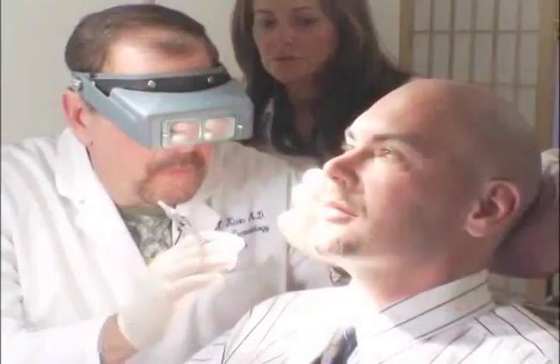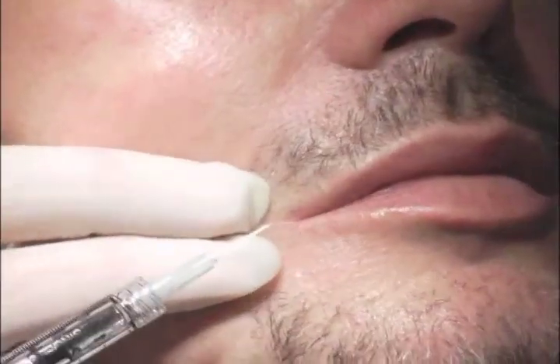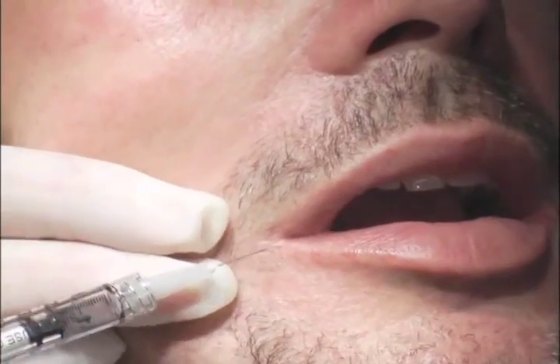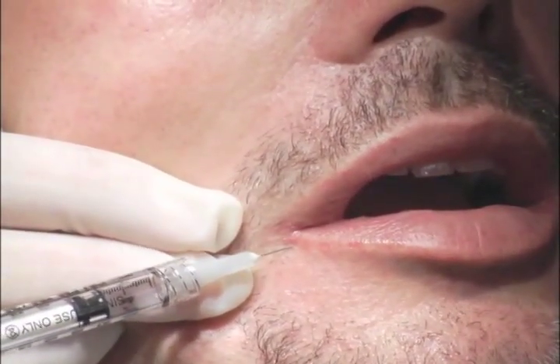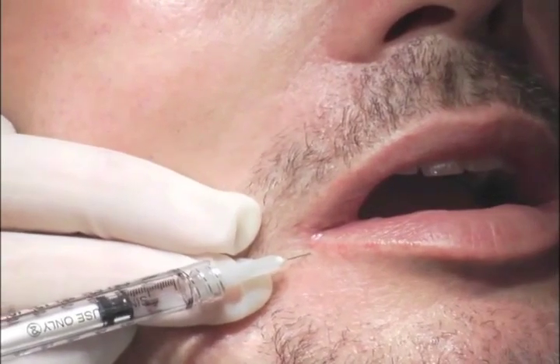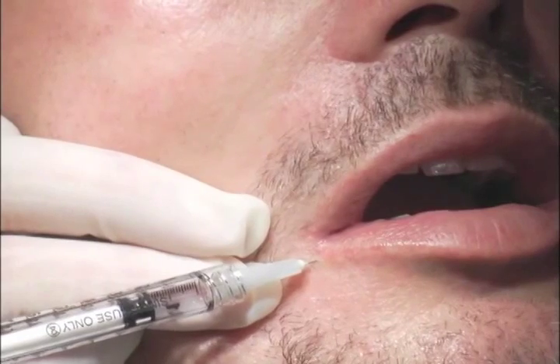So here we go, Juvederm, using Juvederm 30, which is a more robust form, on this side of the face. Okay. What we want to do now is restore the ends of the lips right here. So what we're going to do is open your mouth just for a second, is gently drop the end of the needle on the mucosal side of the potential space, and just gently flow this into the lower lip. And you can see how it gently flows just like that.